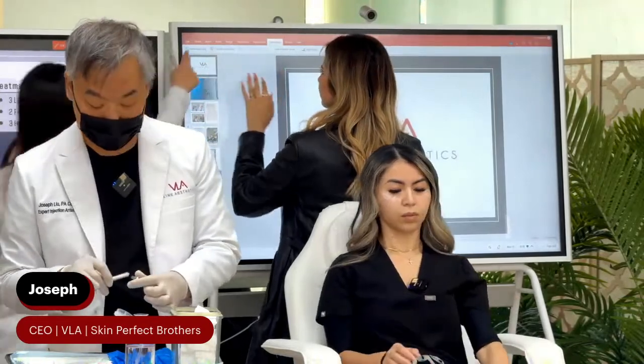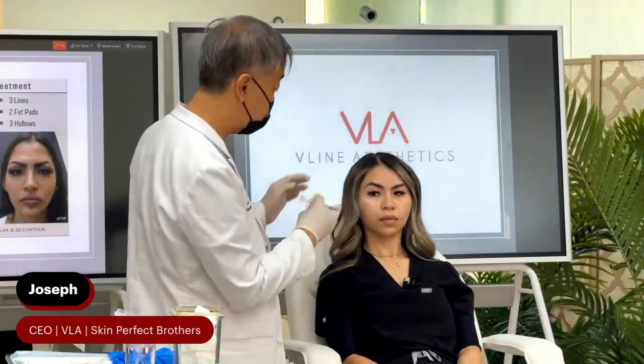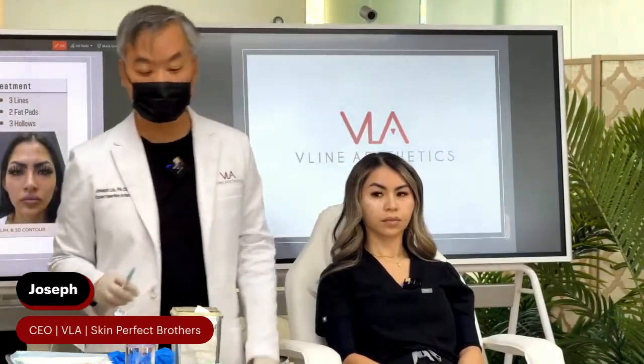I'm not gonna actually inject. Okay, so I won't actually inject. I'm just gonna pretend it's like this. I won't touch your skin. Okay.